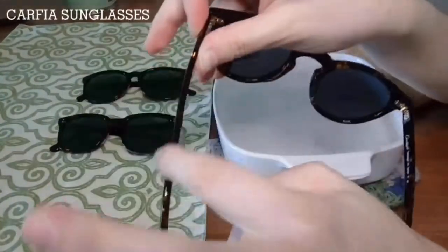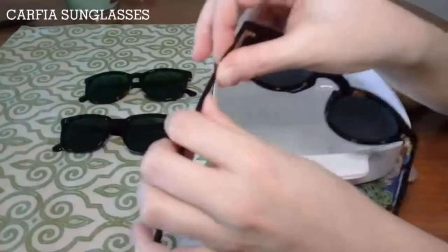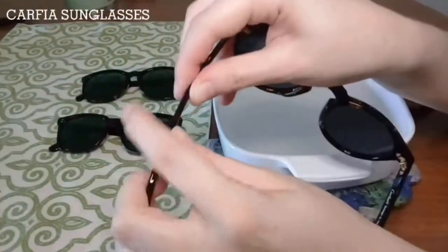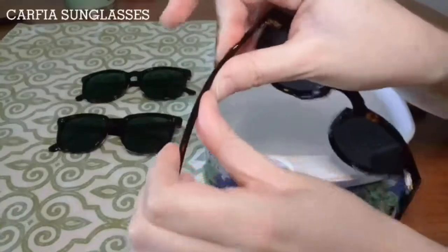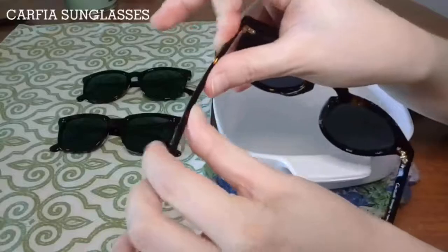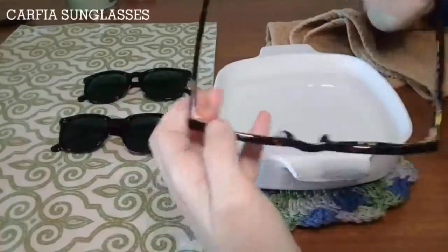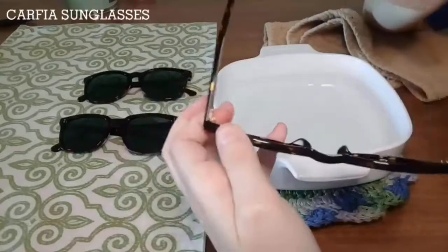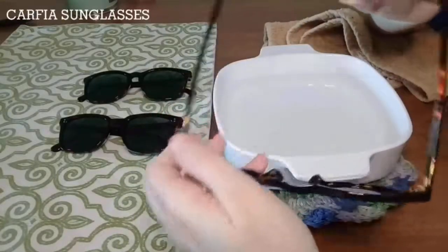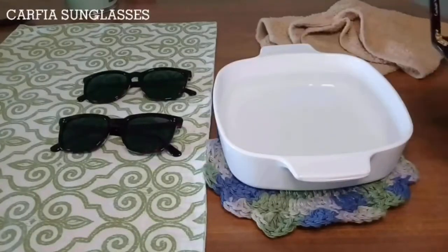And then sometimes you might want to follow it down the side of the temple as well, further down towards the curve. You might want to keep inching along and helping that to form and make a new shape outwards. Okay, so there we go. Now we have a curvature in both sides and each temple, so that when I put these on, it is a comfortable fit. Nothing is squeezing my temples anymore.